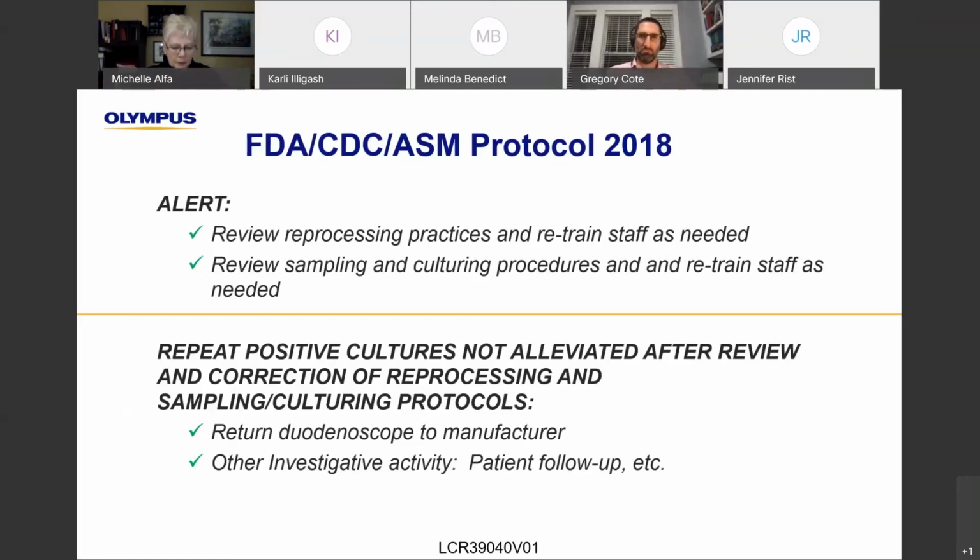Staff will, there's often a written protocol, and then there's what really happens in real life. And sometimes the two are totally different. So I think the idea of an alert is that it's warning you that you're edging to a point that you don't want to be at, and that you really should go over the practices and make sure your staff are doing what they need to do, and make sure they're given enough time to do what they need to do. And so it's a slightly lower acuity in terms of the response than it is if it's an action.